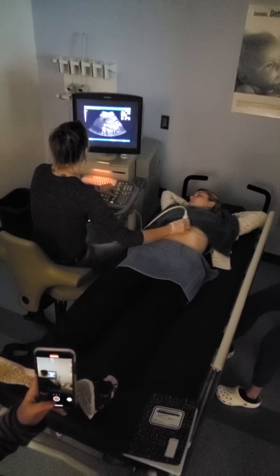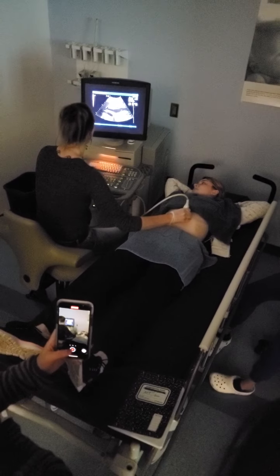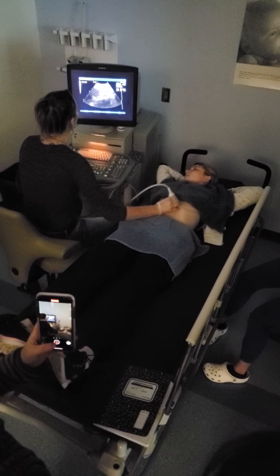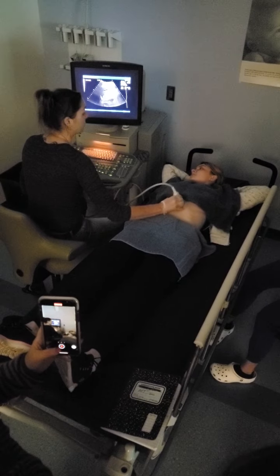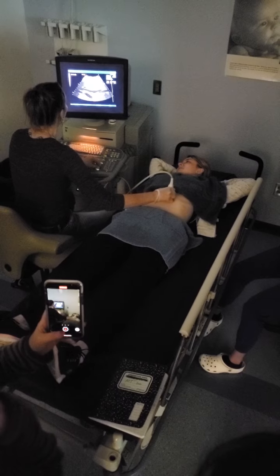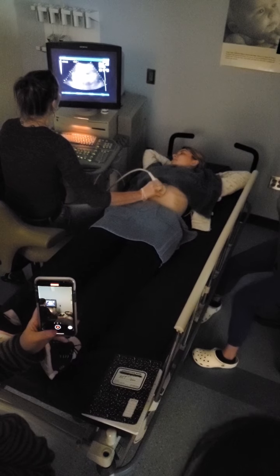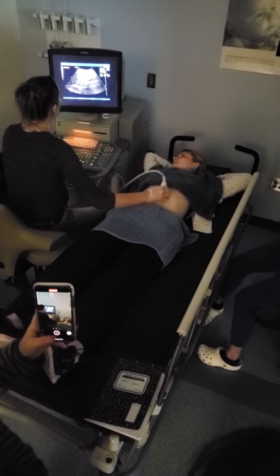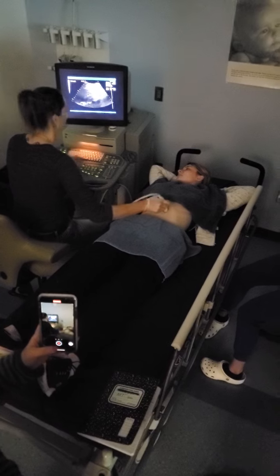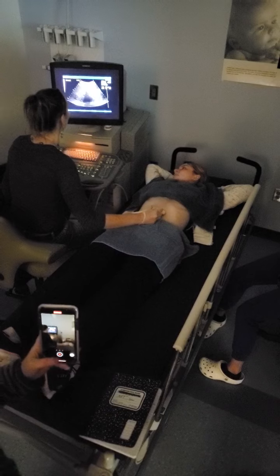Thumbs down, thumbs depth. Okay, so last time we started at our IVC, that was our most medial sag left liver lobe. And we walked our way across to this lateral. So we had our medial, our mid, and our lateral. Then we did our measurement image. Then we turned to transverse. And we aren't really up on that sternum, remember? We're going to do that push and scoop thing.